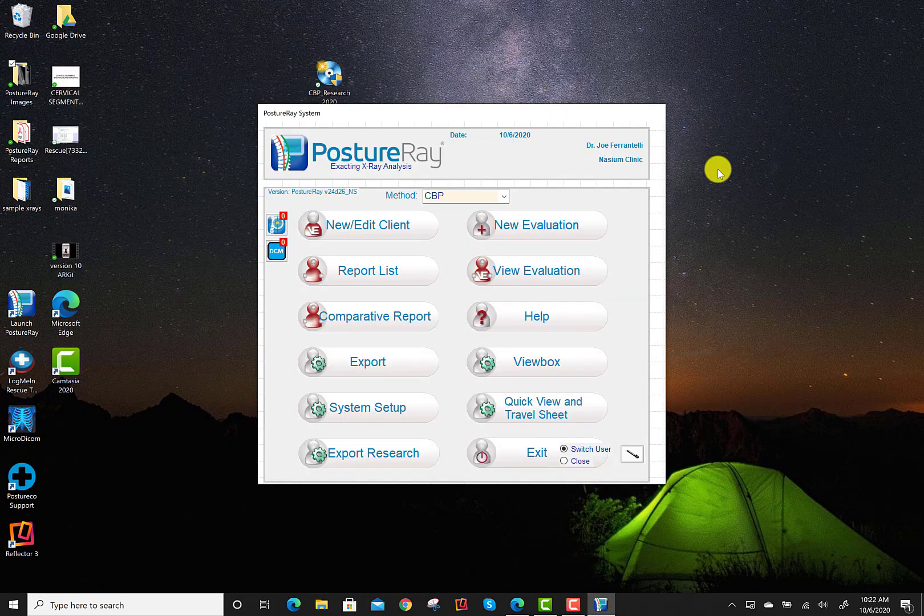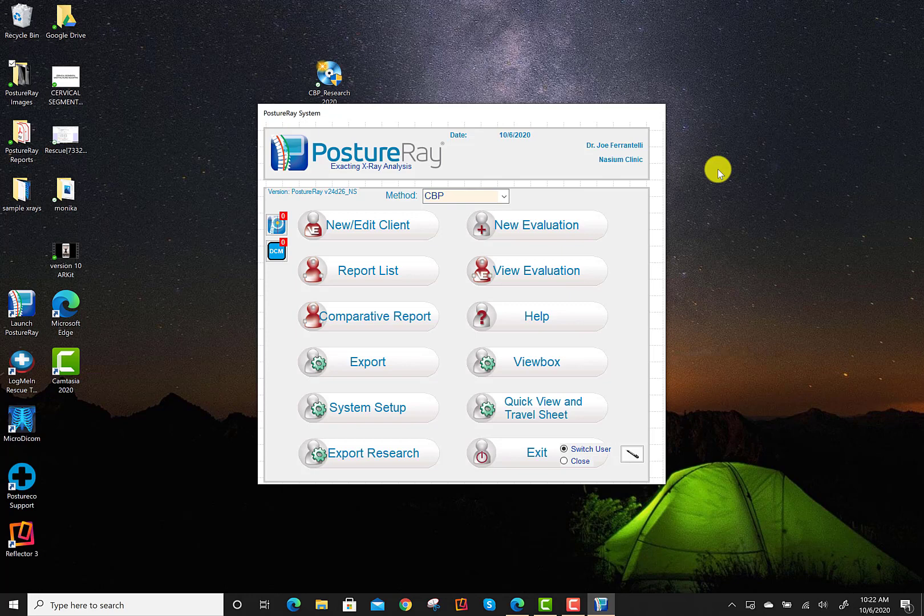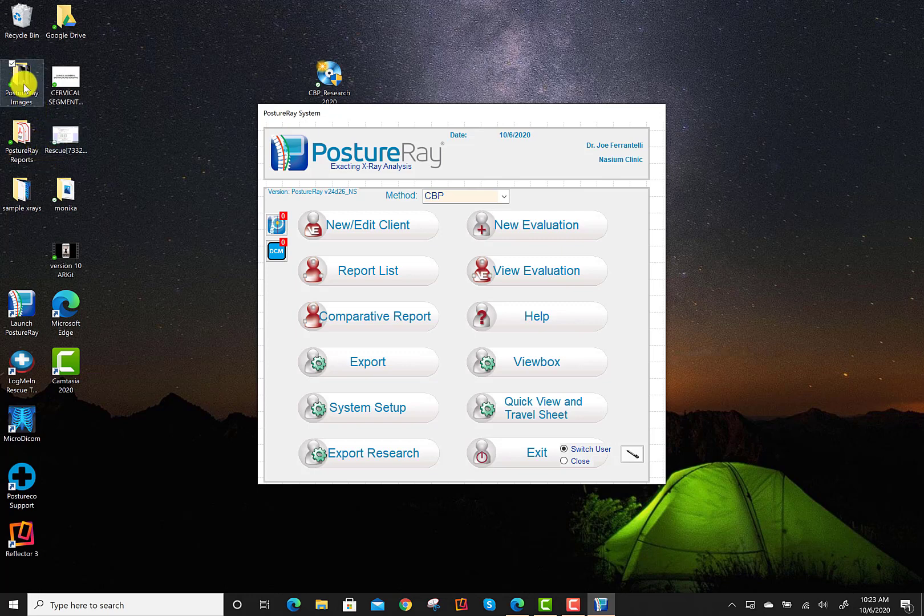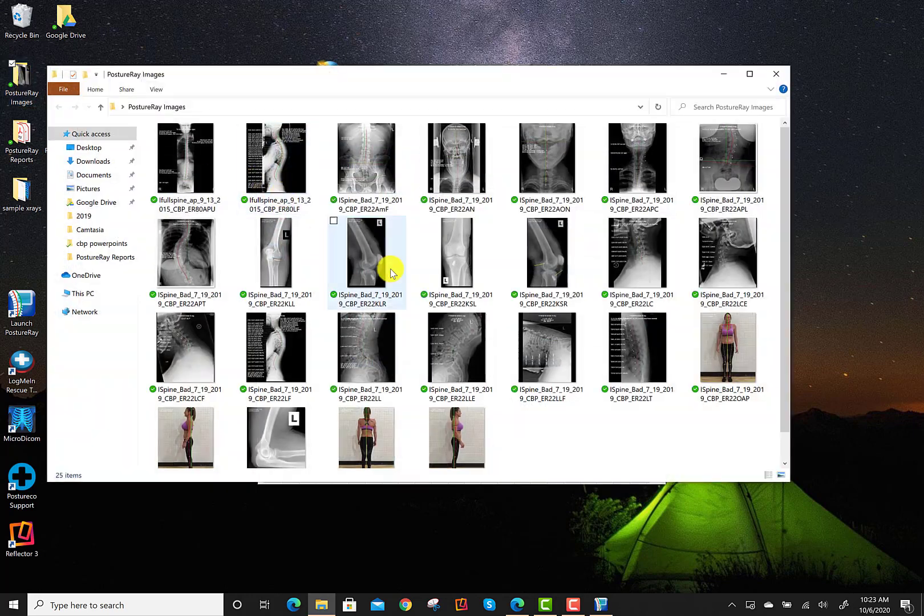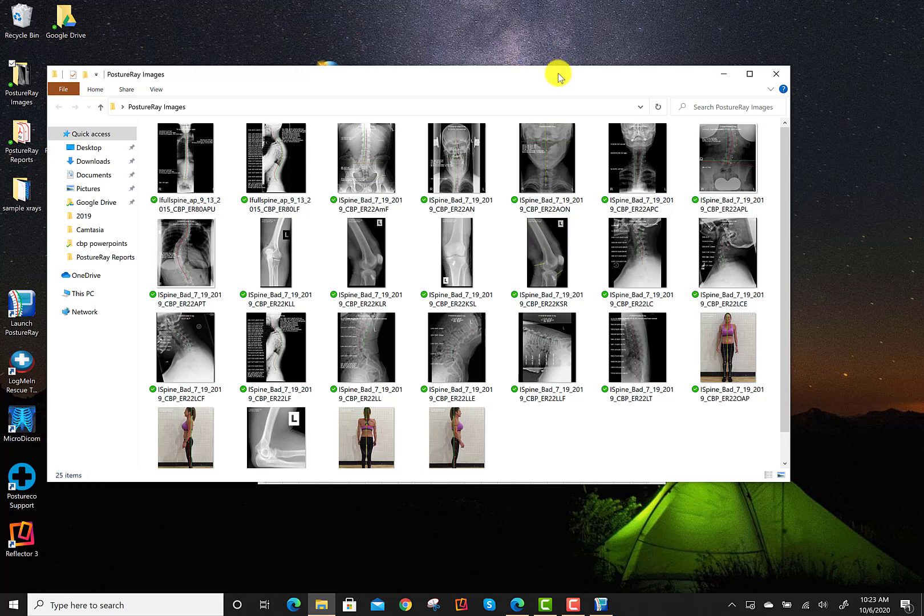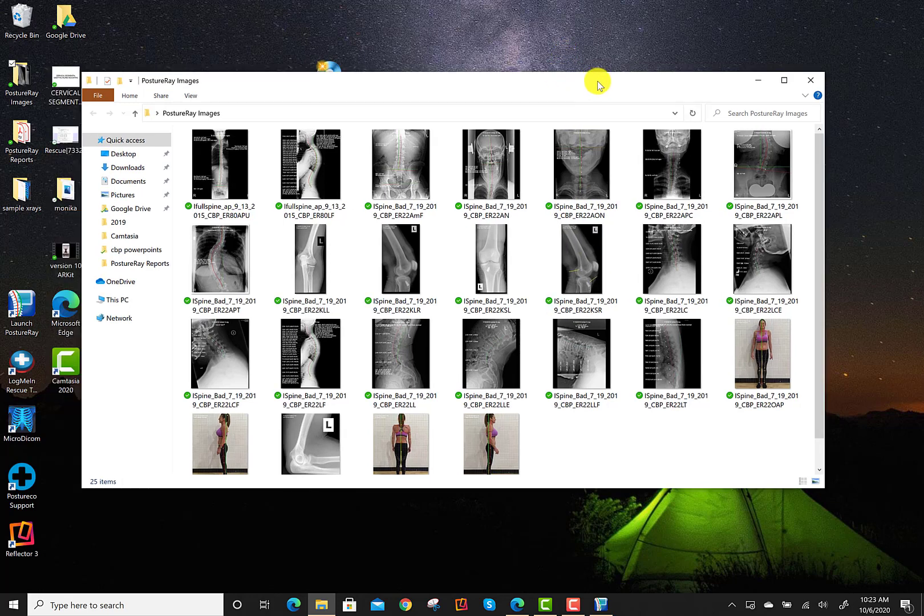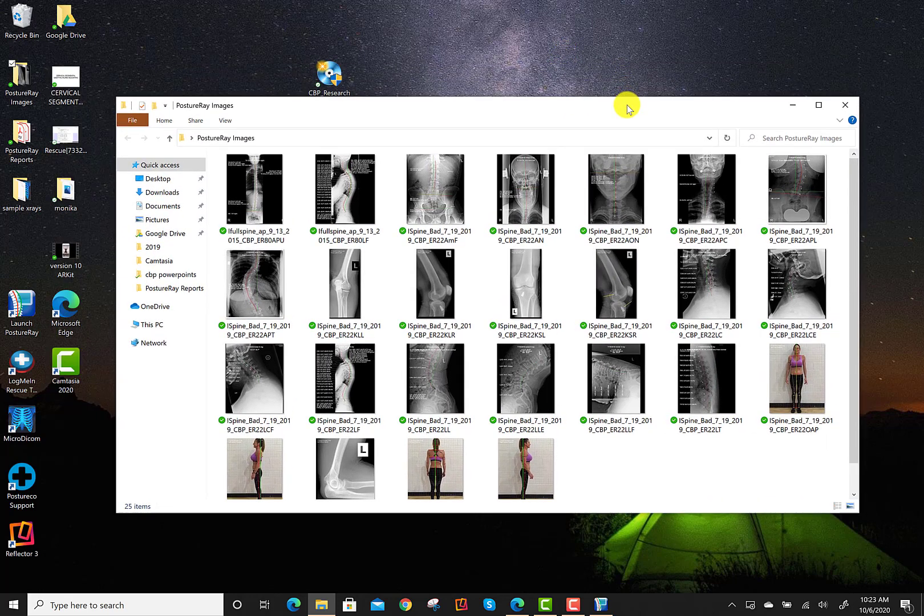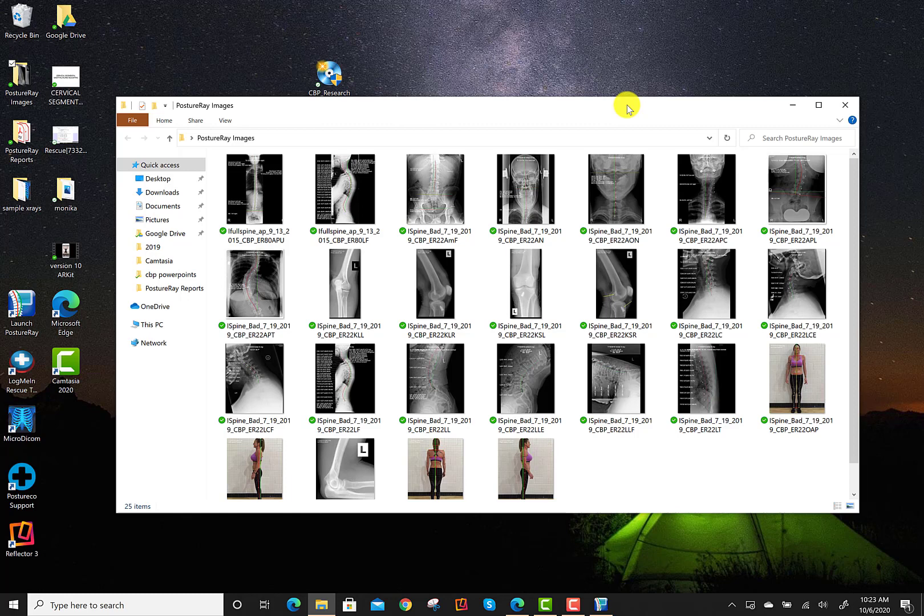Now, currently, you can't export directly to an EHR the other views. So what you would need to do if you need other views to show up, obviously, the posture screen can push directly to EHRs that we work with. But if you needed to export these other images, which are these non-spine images, to the EHR, you're just going to manually have to upload them, save them to your desktop, just like I did here, and upload them. So with that said, if you have additional questions, please reach out to us at support at postureray.com. That's how easy it is to export. Just always check that view filter. Thank you.